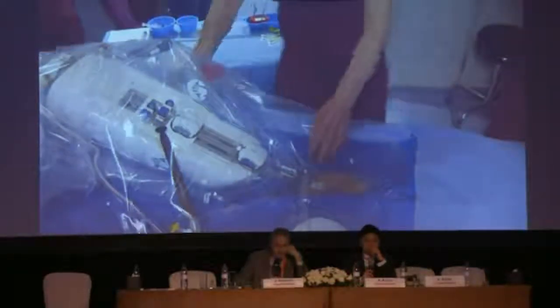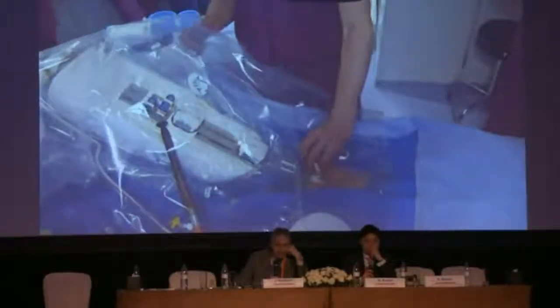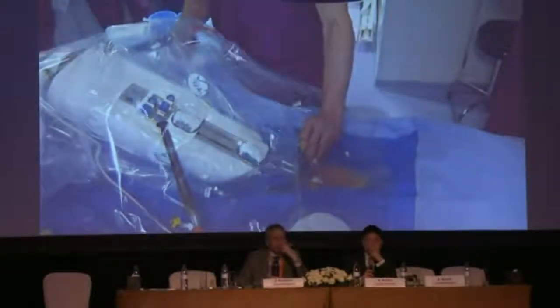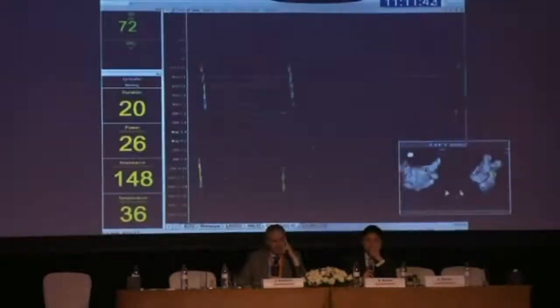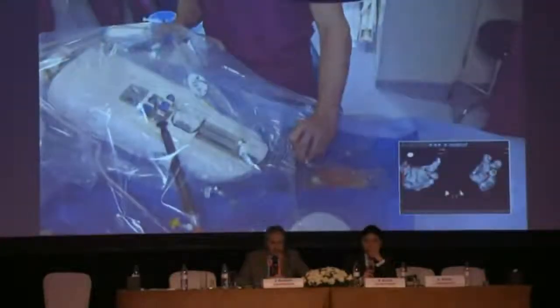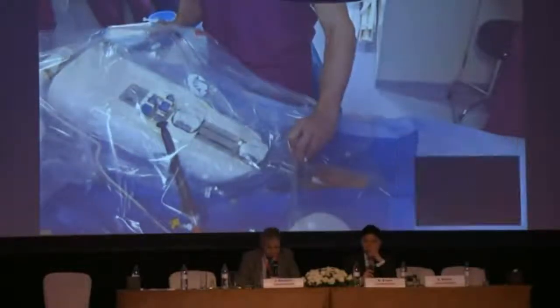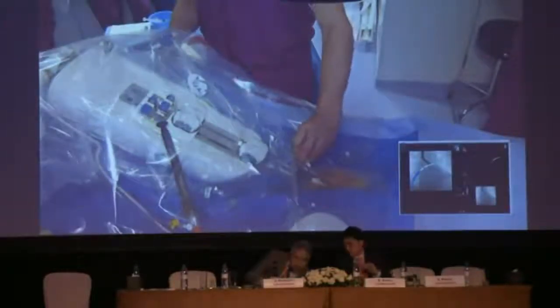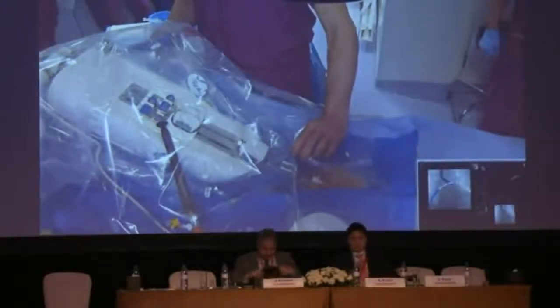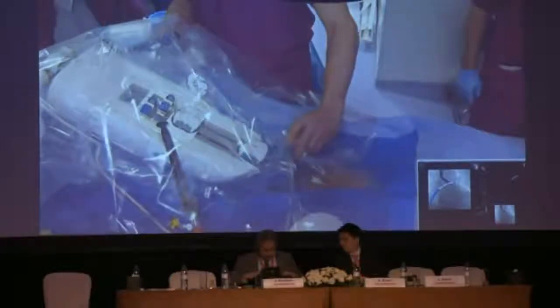So I was partly using the PV and CS signals. As I mentioned before, it was CS distal to proximal, so I know it's unlikely to be coming from the posterior septum. I saw that the appendage signal was earlier than the CS distal, so it was more likely to be coming from anterior than somewhere between the CS and the appendage. And then I put my mapping catheter septal of the appendage, and I was then looking at the relative timing of the distal and proximal.